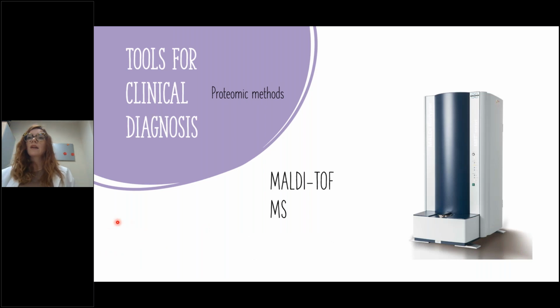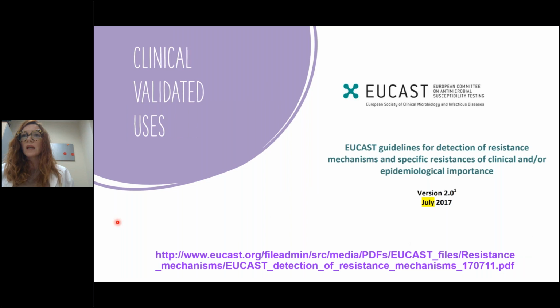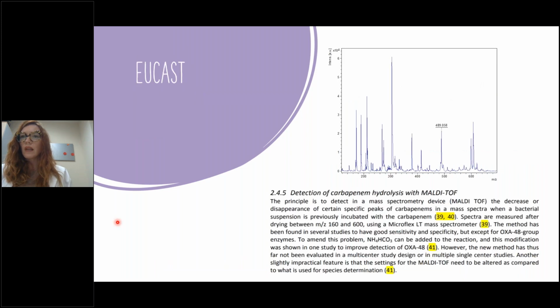In this line, we also have MALDI-TOF, of course, which is the main topic of this talk. It is a proteomic method. It was introduced in the last EUCAST guidelines for detection of resistance mechanisms and specific resistances of clinical and epidemiological importance. You have the link here.